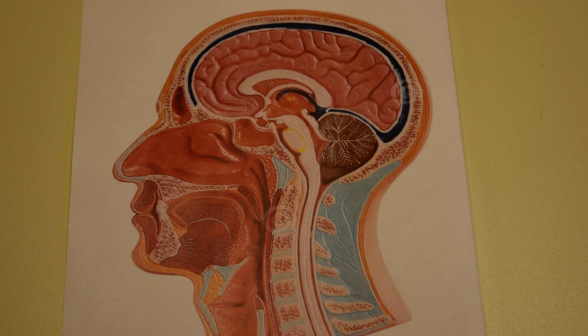One of the other major tips that I can give is to utilize a whole lot of lubrication on your NG tube. I have utilized the Muco jelly that we utilize for catheter insertions, as it has xylocaine in it, as a substitute to regular Muco if you feel that a patient may not tolerate things very well.